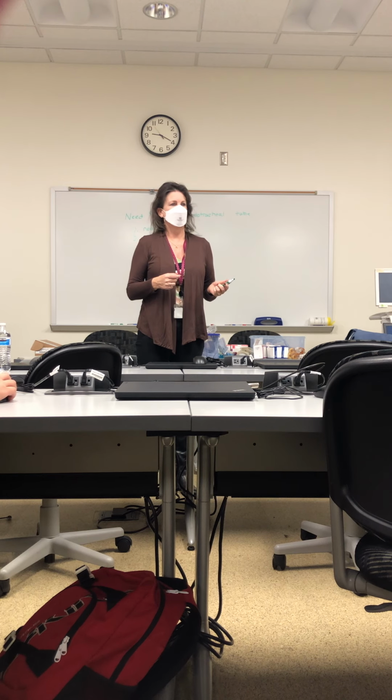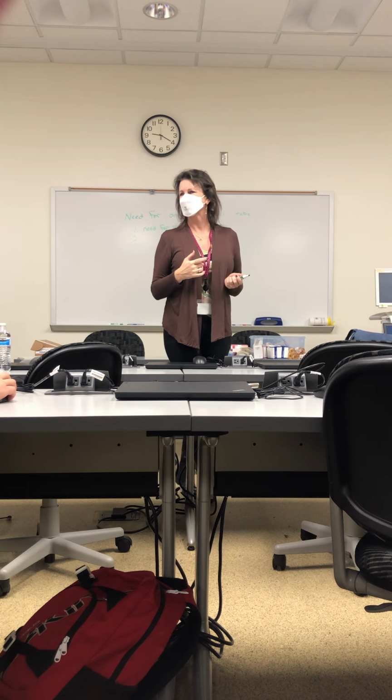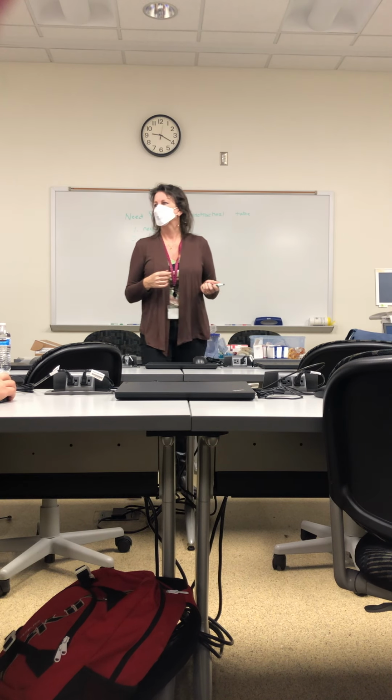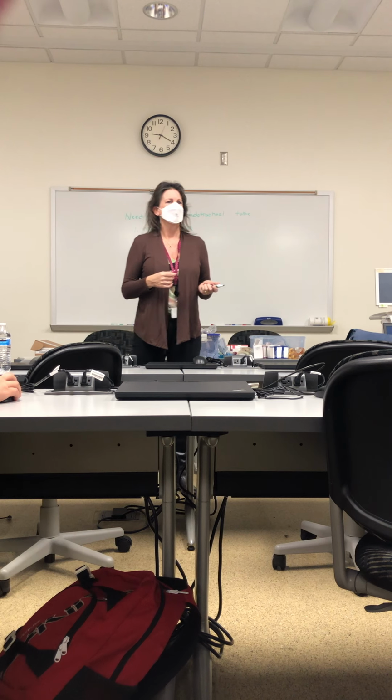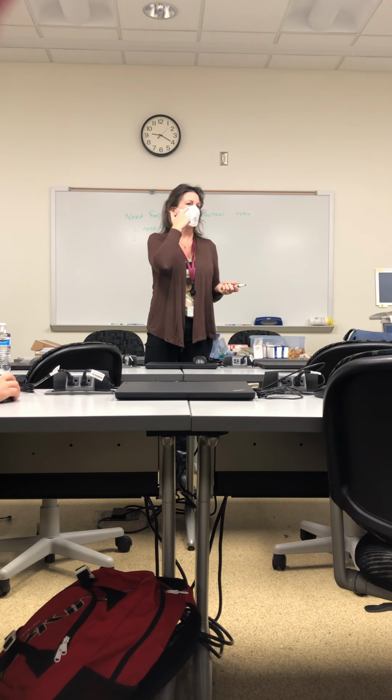What else can we do to prevent any mucosal injury to the nasopharynx? Don't pull back every time; I'm causing injury right as I go into the naris. So you've lubricated it, that's good. What else can you do?